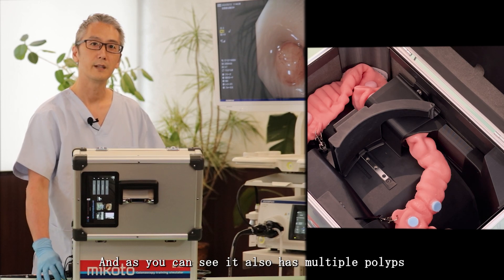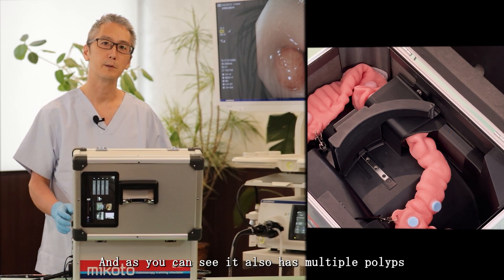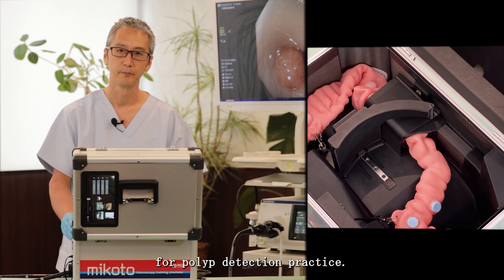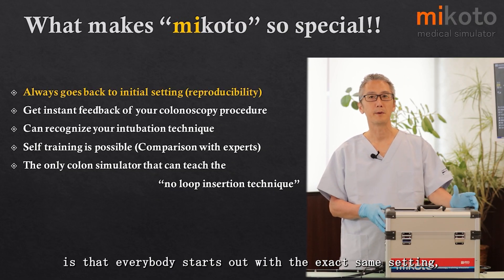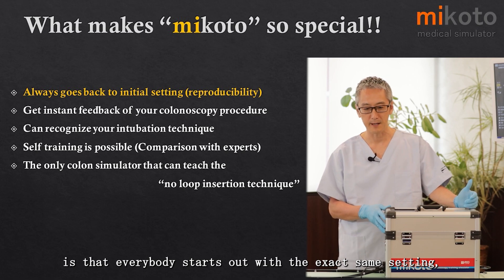It also has multiple polyps for polyp detection practice. What makes Mikoto so special is that everybody starts out with the exact same setting.